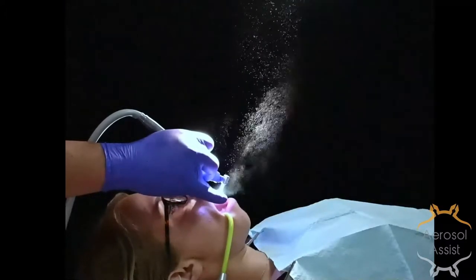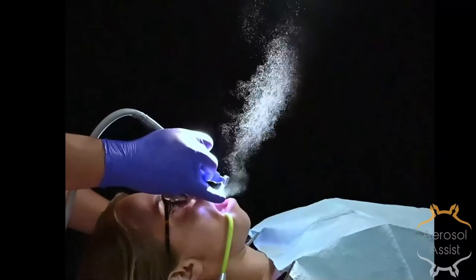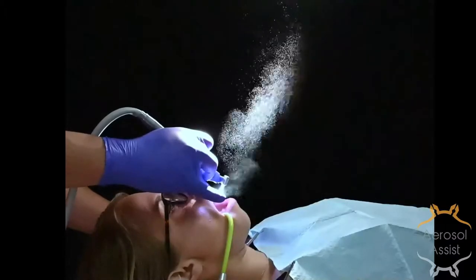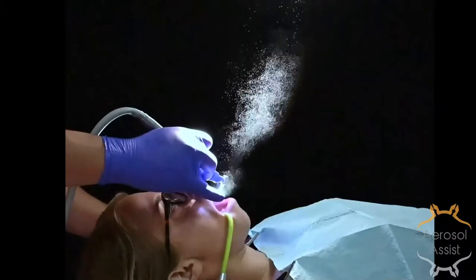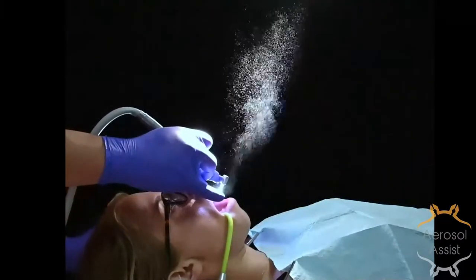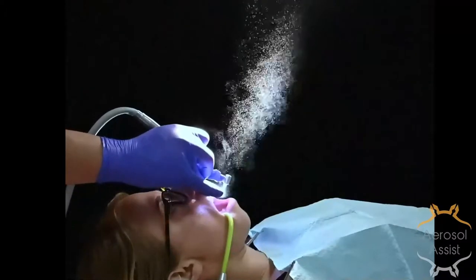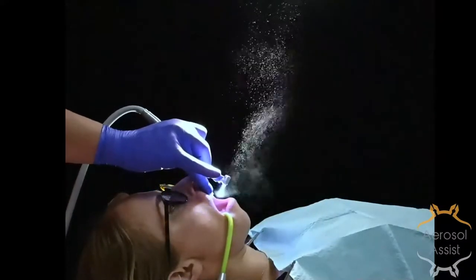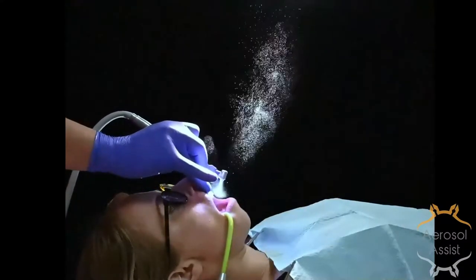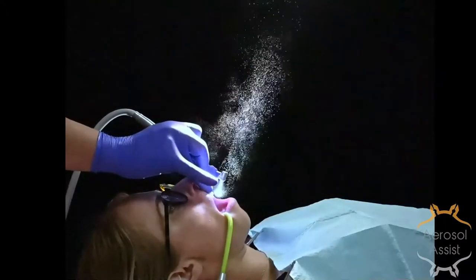The rest are so small that they cannot be visually detected and remain invisible to the naked eye and the camera. The greatest amount of aerosol concentrations are generated 1 to 3 feet from the source, which in the case of a dental professional is right in the work zone.